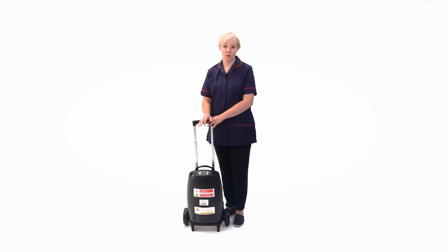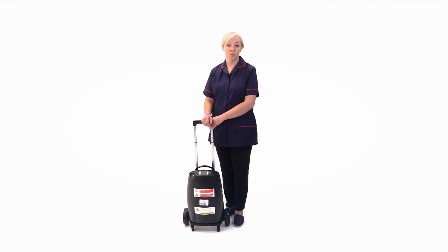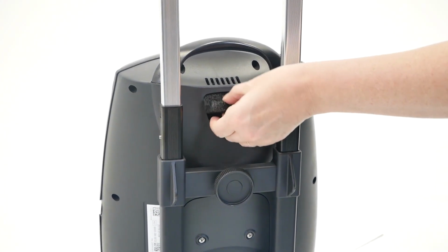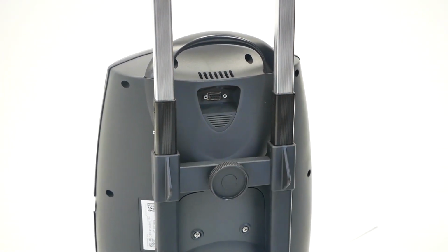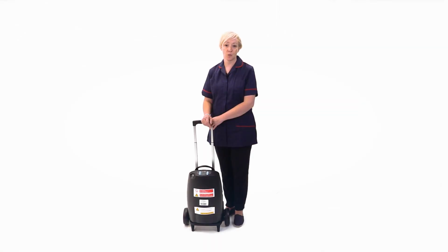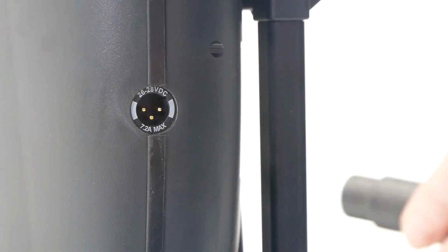Looking after your concentrator, the air intake filter must be removed and cleaned at least once a week. The air intake filter is located on the upper rear of the device and can be removed and cleaned with soap and water. Allow to dry thoroughly before reinstalling the filter. The power cartridge or battery must be calibrated once a month. This consists of fully discharging the battery to 0 and recharging fully from an empty state.